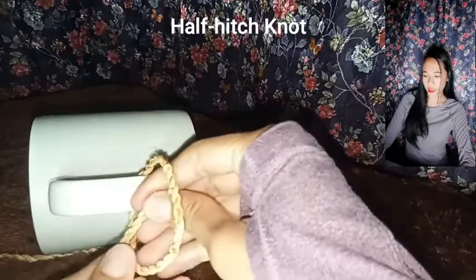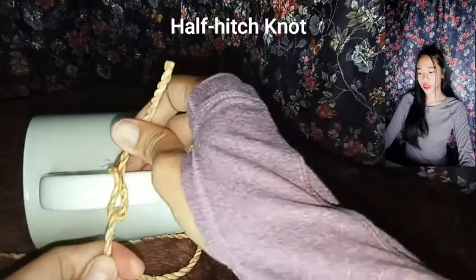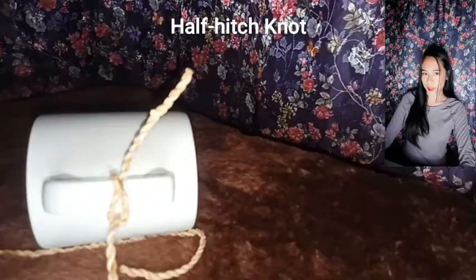Half-hitch knot — it is most often created by incorrect knotting technique and results in a knot that readily slips.